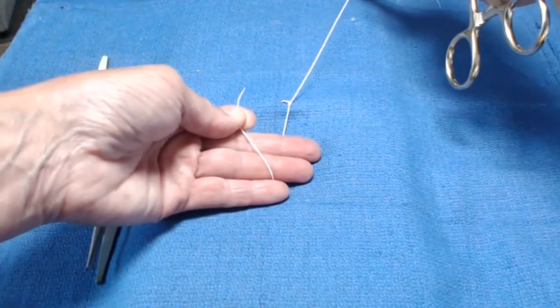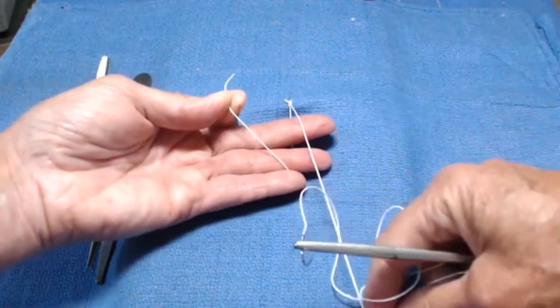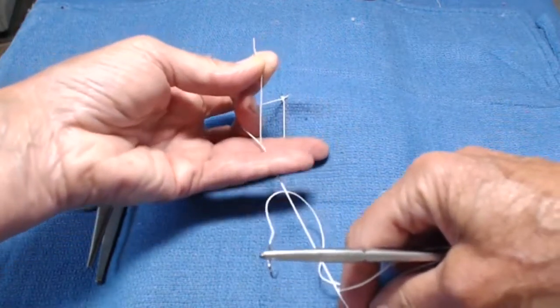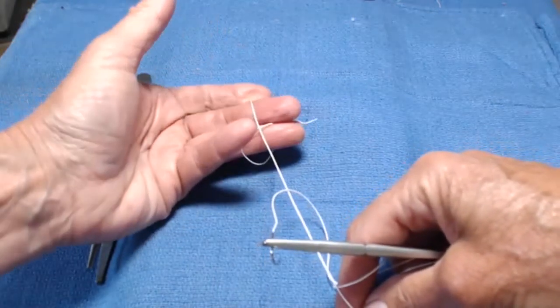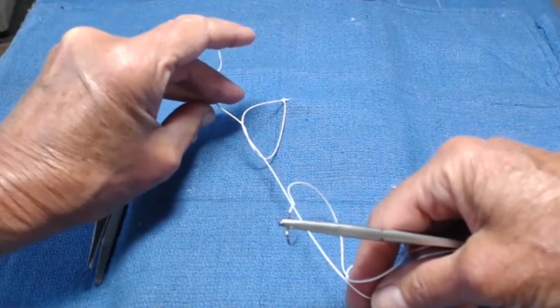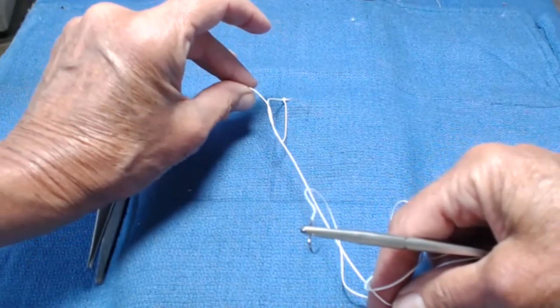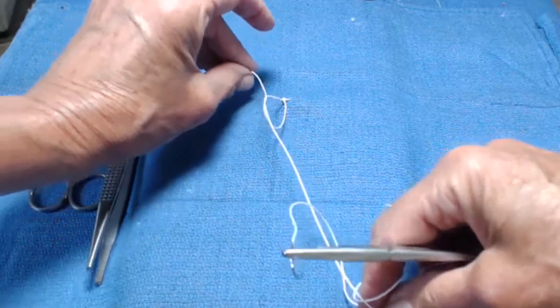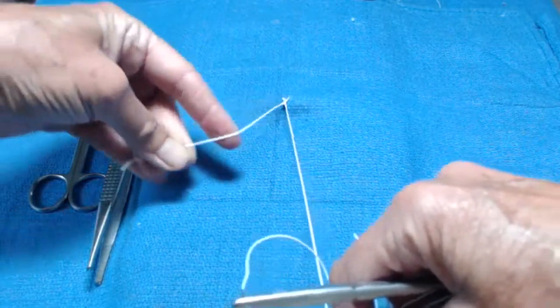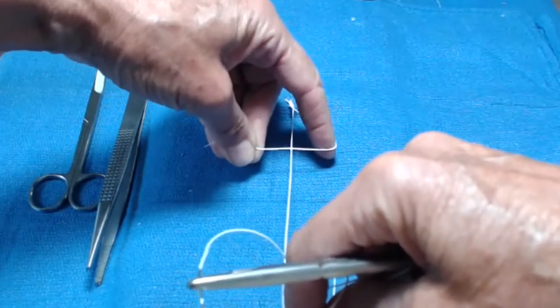And that puts me exactly in position to do the first throw of the knot again. Laying the long end across my middle and ring finger, bending the middle finger, pinching the suture between my middle and ring finger, turning my hand palm down, looking for that perfect half knot, swinging my thumb to pinch the suture between my thumb and middle finger, and then gently tighten the knot down, pointing away. Take my pointer finger, push the suture over until I have a triangle or a reverse four, as some people will say.